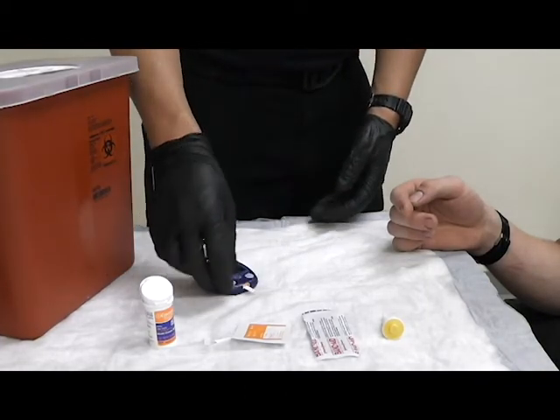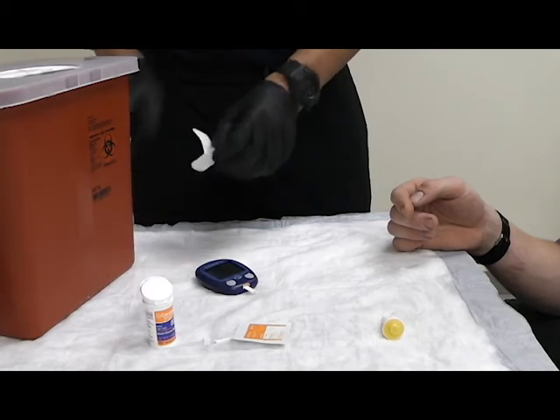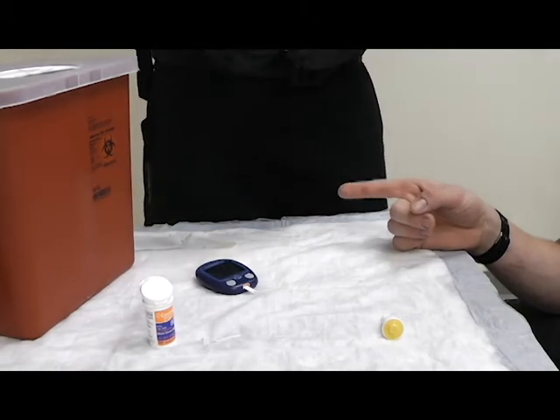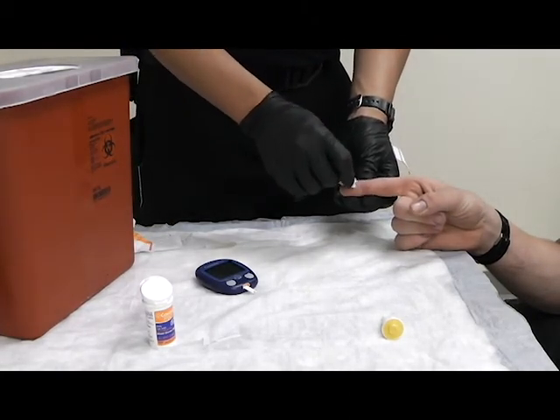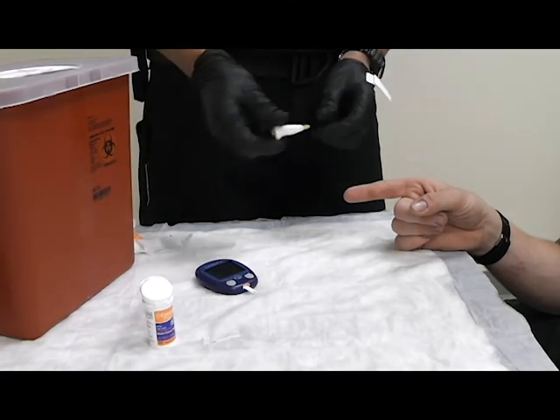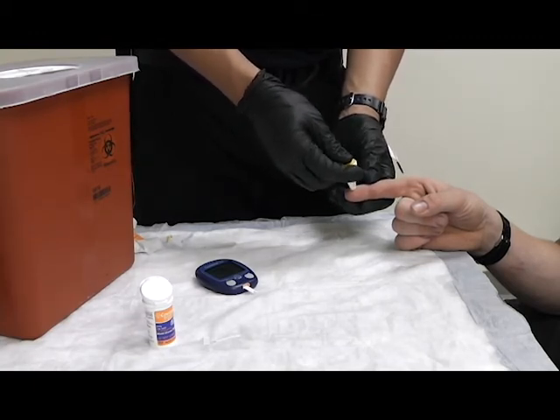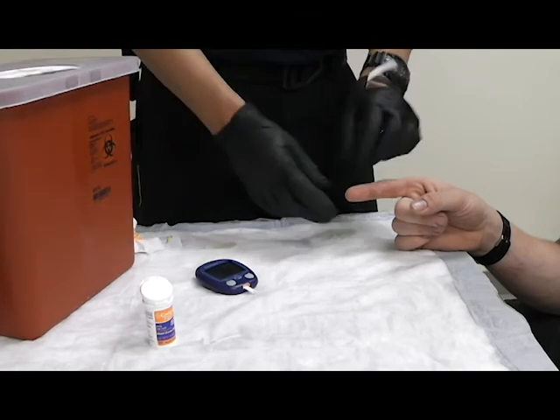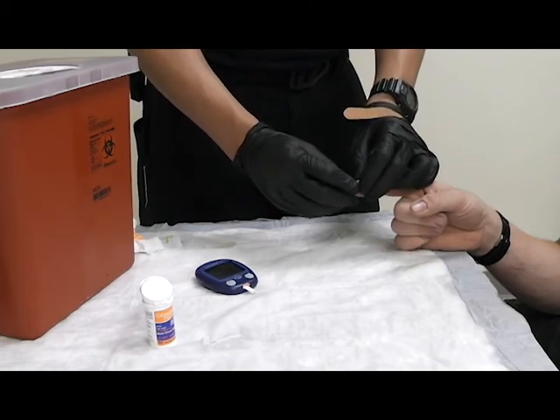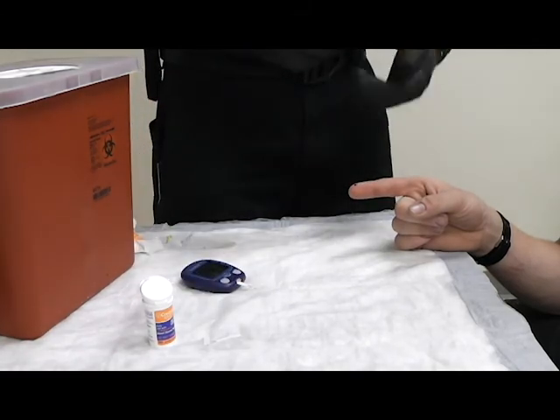Once the test strip is confirmed functioning, set that to the side and prep your bandage. Take your prep swab and clean the finger in a bullseye pattern from inside out, then let that dry. Once dried, take your lancet — sharps out. Verbalize to the patient, then stick on three: one, two, three. Dispose of sharps immediately. Squeeze a little bit to get some blood. Once enough blood has come out, obtain it with the strip, set that to the side, and immediately apply the bandage.